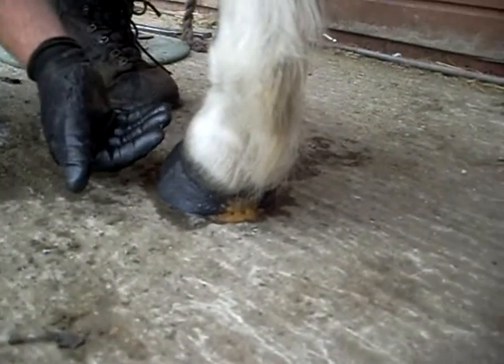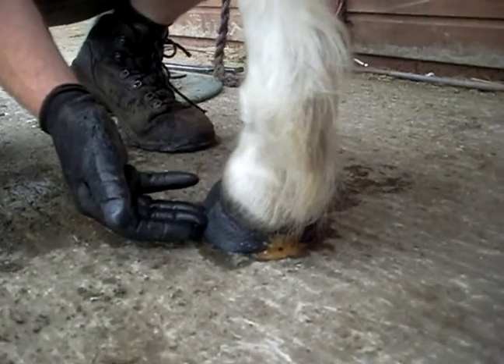I put the shoe on first with the hoof packer and then the hoof cast — and this is what I'm doing here.